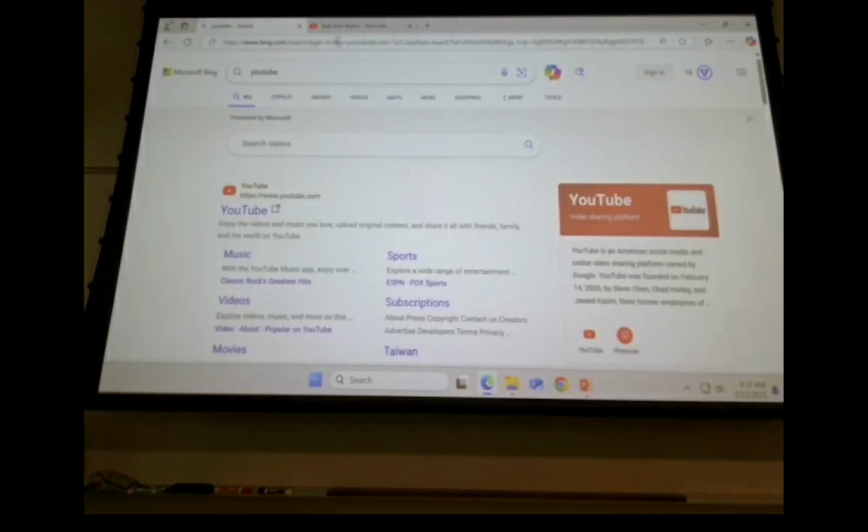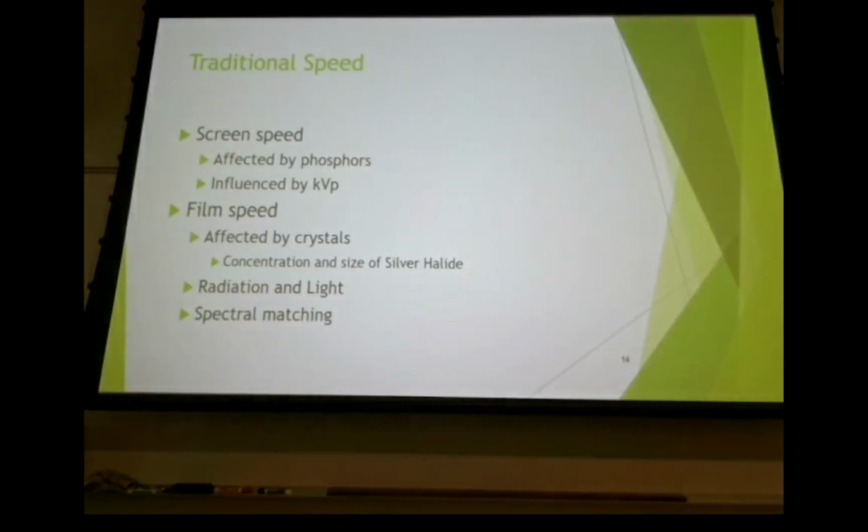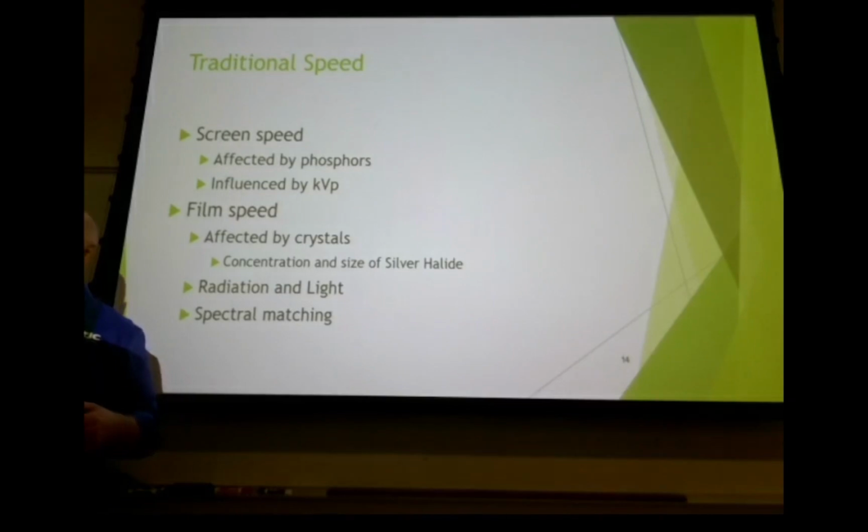So what happened with our screens is our films were light sensitive. They're sensitive to all different kinds of light. Different manufacturers had safe light options. So Kodak, for example, worked off of a green spectrum. Well, what's green? How do you get green? Blue and yellow, right? So it was sensitive to blue and yellow light primarily. It wasn't sensitive to red light.